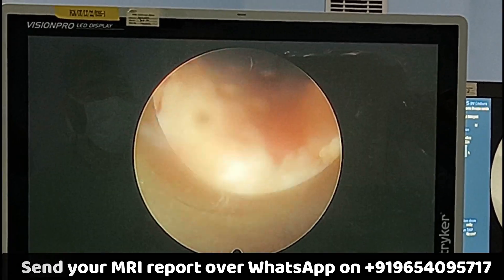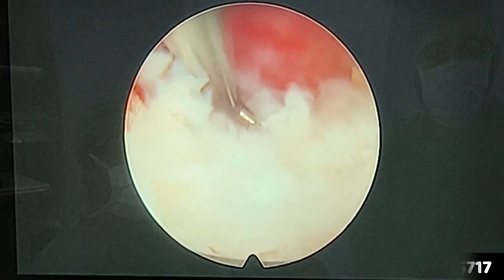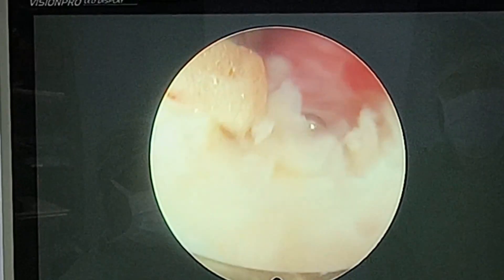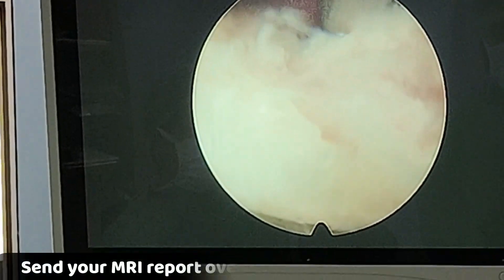Here you can see the magnified image that we see through the endoscope. The magnification here is almost 20 to 25 times and the aim is to make the nerve root free. Here you can see this red structure — that is the nerve root. We are retracting it using a special instrument known as the surgical hook.